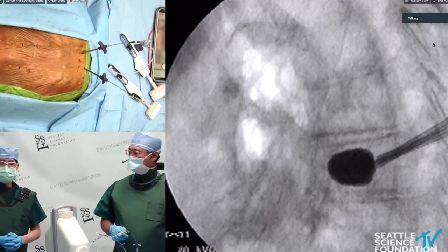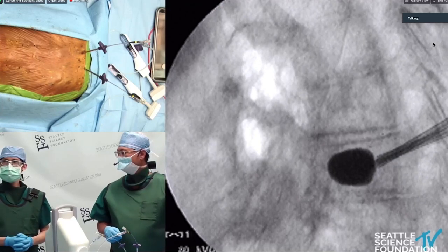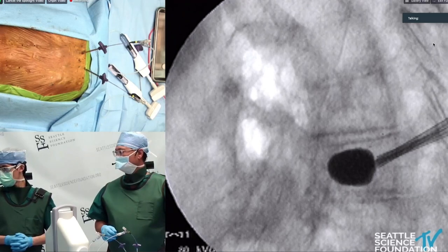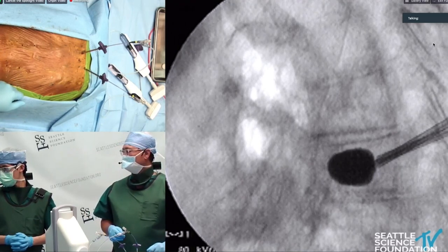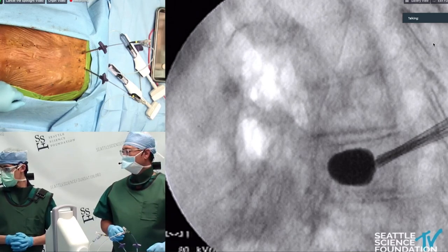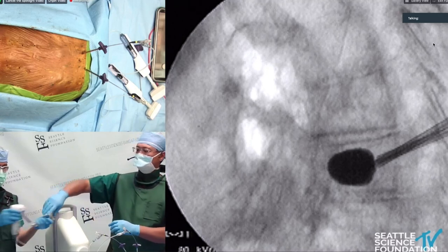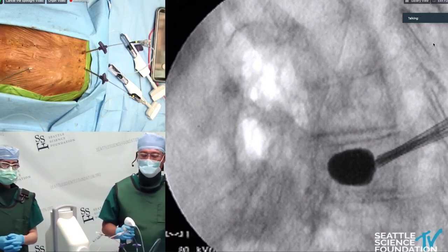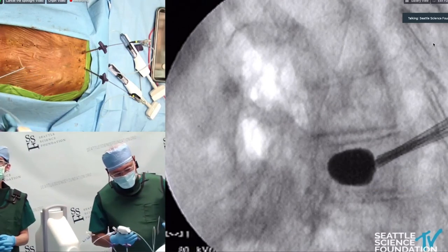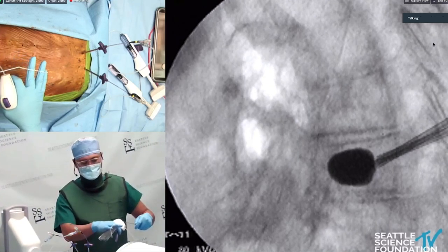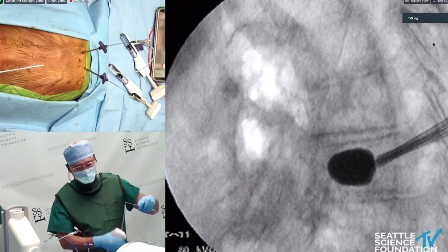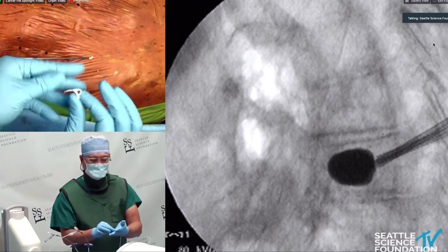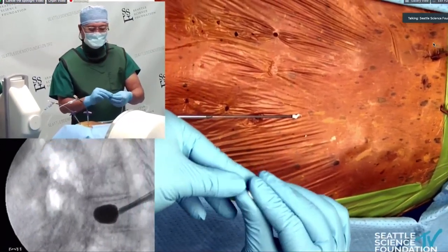The cement should be almost ready. Making sure the cement is really thickened up — no longer any glistening sheen to it — with a really doughy consistency that doesn't stick to my fingers.